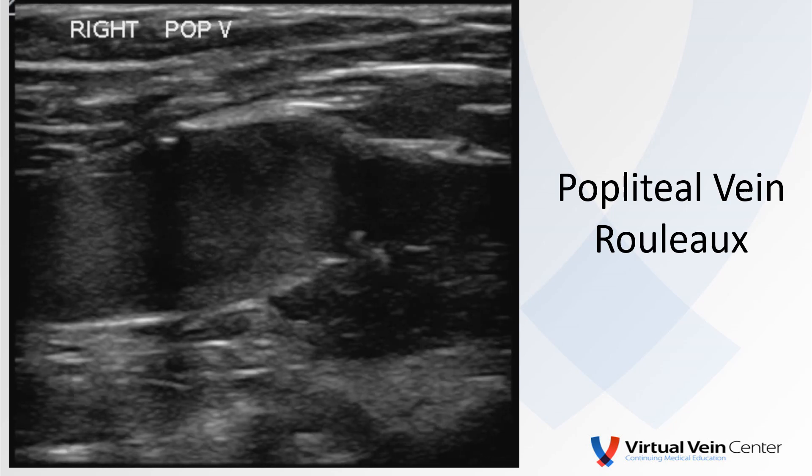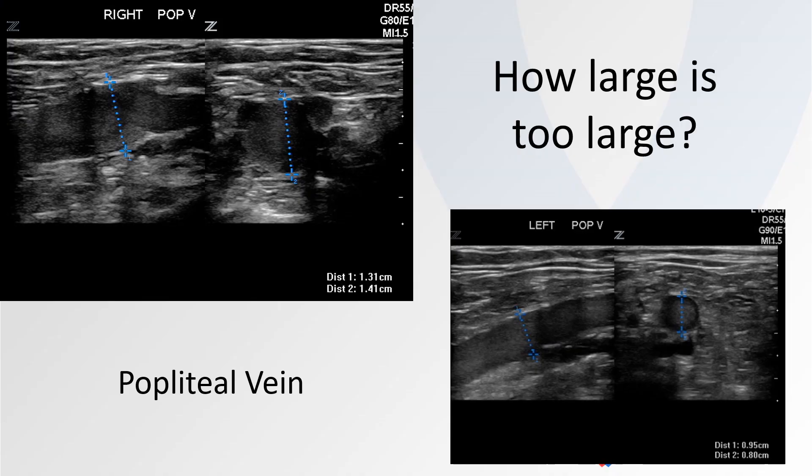So would you classify this as aneurysmal? Is that a venous aneurysm? Well, the definition of venous aneurysm is somewhat controversial. I've heard it expressed as similar to an arterial aneurysm — that is, one and a half times the adjacent segment — and this may fit with that. However, I've also seen valve sinuses that probably result in a one-and-a-half times dilatation compared to the adjacent segment, and you certainly wouldn't want to hang a diagnosis on a patient with a prominent valve sinus. We can compare to the contralateral leg, and in this case it's certainly one and a half times the contralateral side, but I'm not sure I would classify this as an aneurysm.